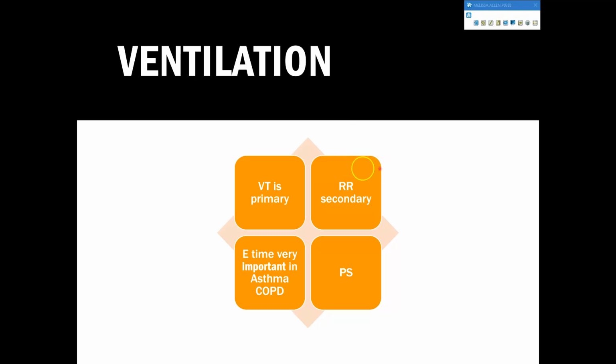So respiratory rate's what we use. So CO2 is high, we go up on the respiratory rate. Now, if we are in SIMV and we have pressure support, that also does contribute to CO2 removal or ventilation, because think about it, it's going to make our spontaneous breaths bigger.